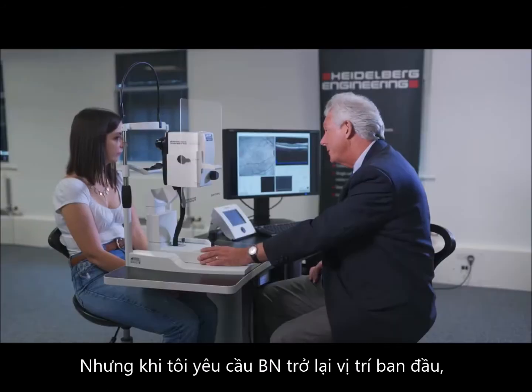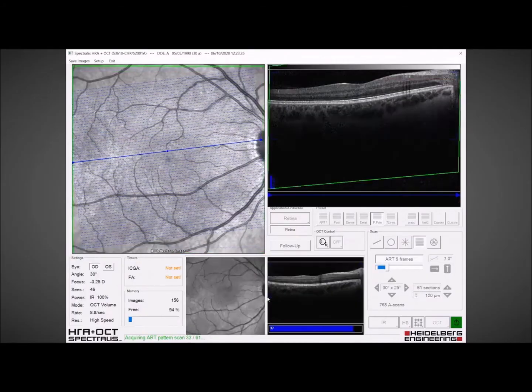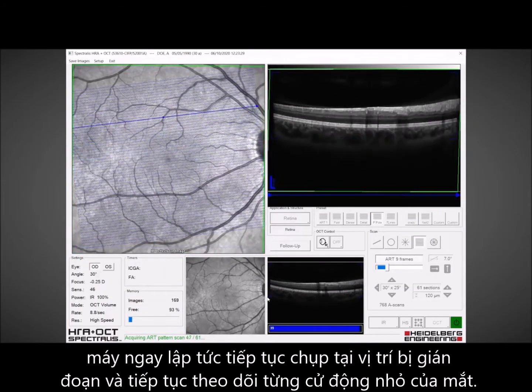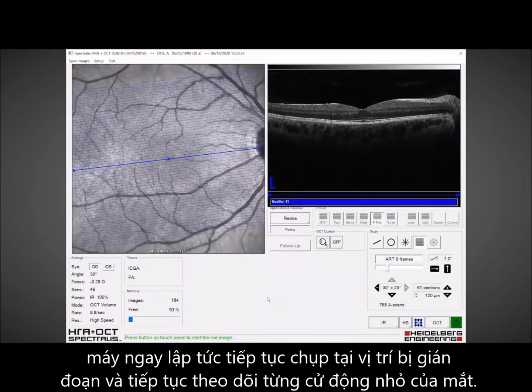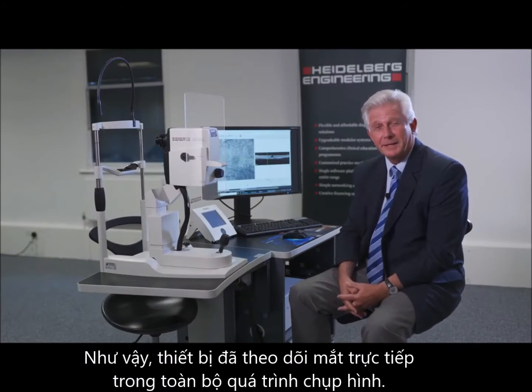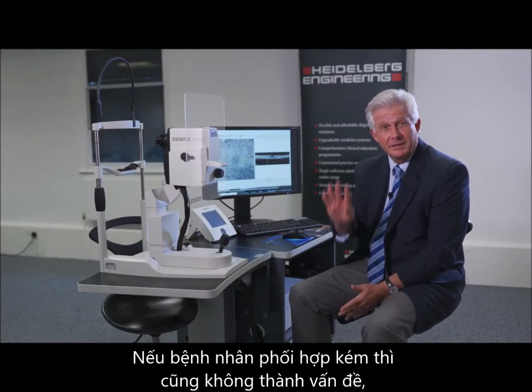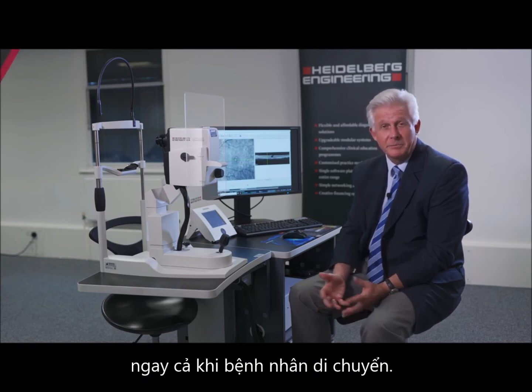And if I ask my patient to come back in position, we catch up exactly where we left off and continue to track the eye live. So we're tracking the eye live all the time. It doesn't really matter if your patient only has confrontation vision. We're always going to know the location of the OCT relative to the fundus image, even if they move.